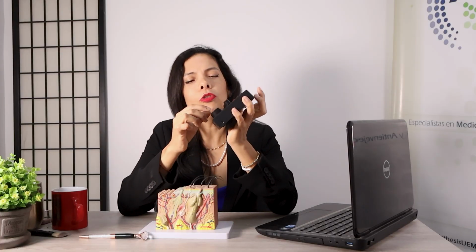And I'm going to take this thing here. Do you know what this is? This is to modulate the volume and the effect of a microphone. So as you can modulate the things on a microphone, you can also modulate how you're going to burn and how deep you're going to go in that skin.